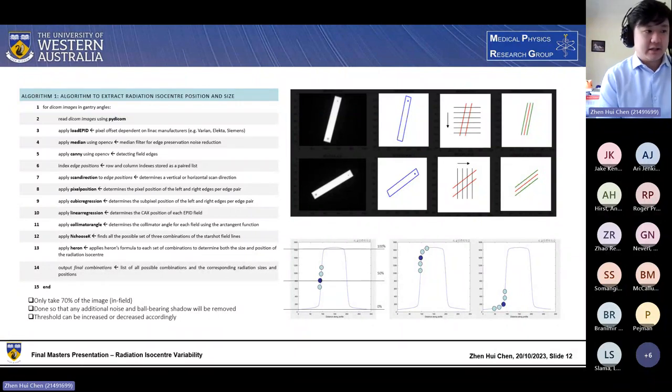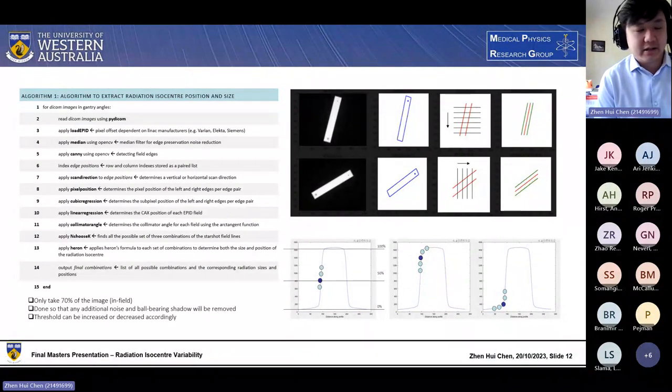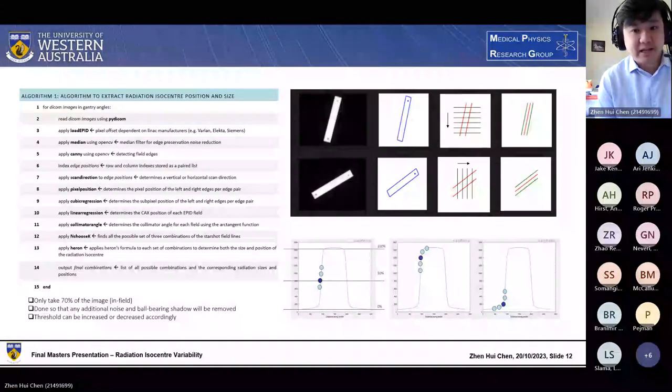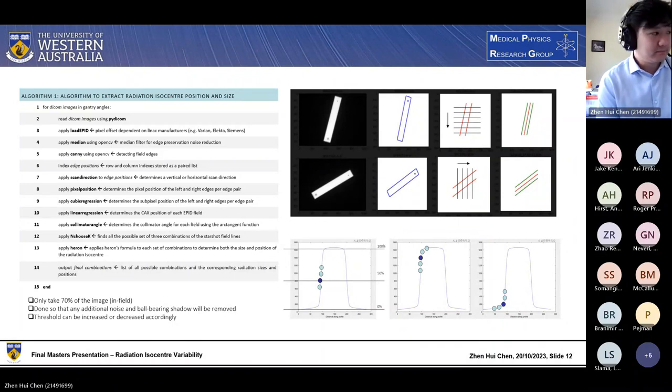It's because if we look at the image at the bottom, if I did not take the 50%, what could happen is that the pixel point that I chose for the canny edge detector, because it works based off of gradients, that edge position could actually be at the top of the shoulder or at the bottom of the shoulder on the left and right edge of the profile. So taking the point closest to the 50% and then extrapolating from there would result in much more accurate analyses.